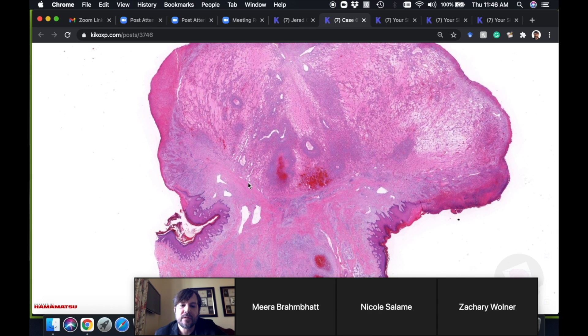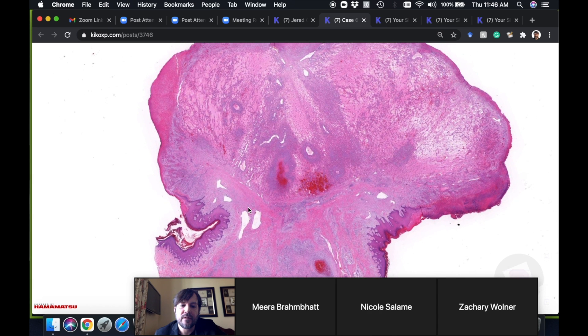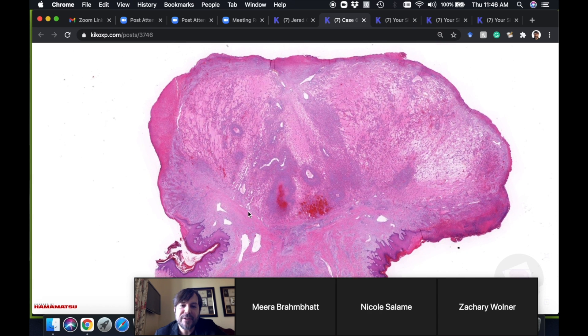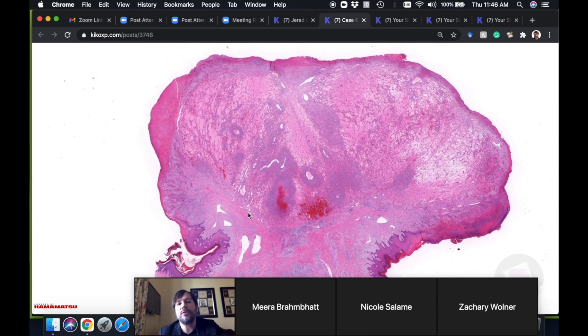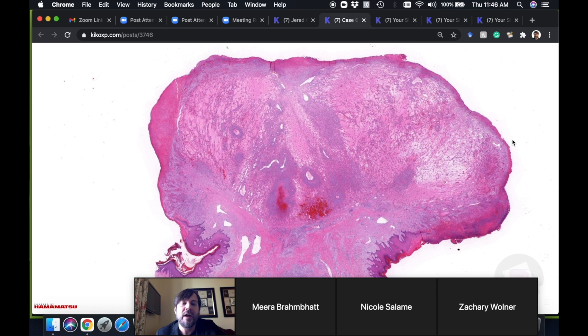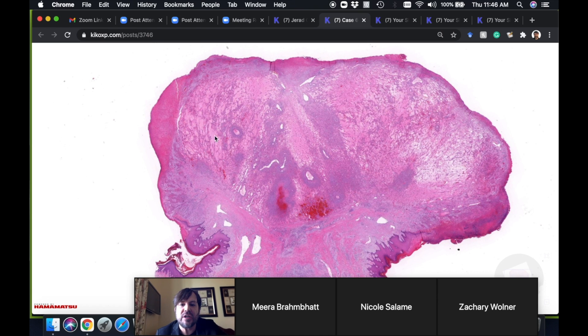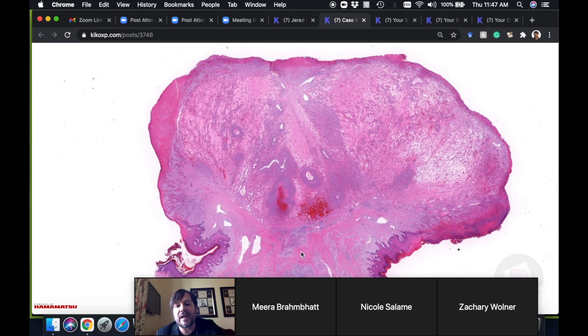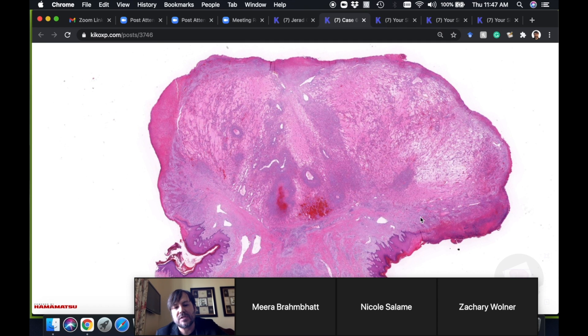We thought maybe pyogenic granuloma. Very good, you thought correctly. This is like the biggest pyogenic granuloma or lobular capillary hemangioma as they're also called—the biggest one I've ever seen, probably. It's huge.